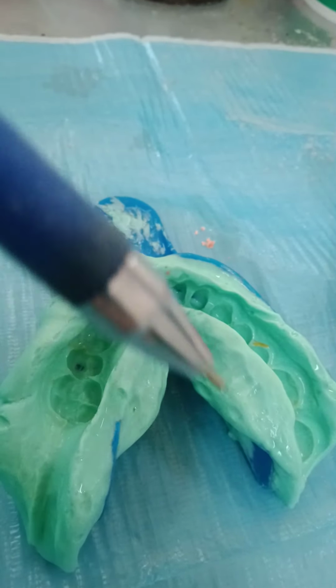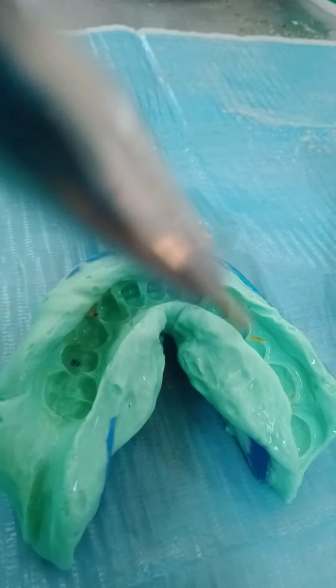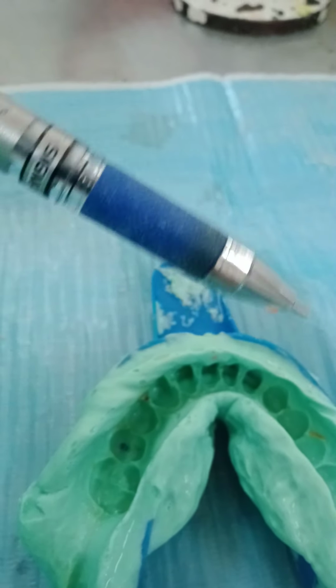You don't have a tongue trap, that's good. You recorded the lingual pouch area all around, and the lingual sulcus anteriorly. That's fine. The lingual pouch, not all of it, but we don't need it now. But in case you need it, you can extend with utility wax before taking the impression. So the lingual sulcus, the labial sulcus.